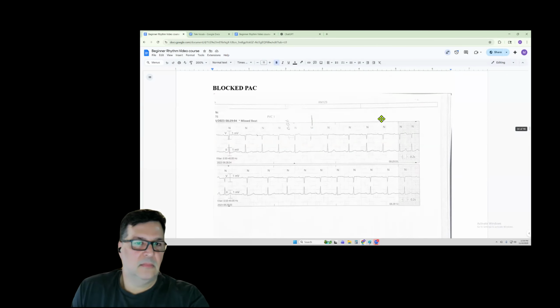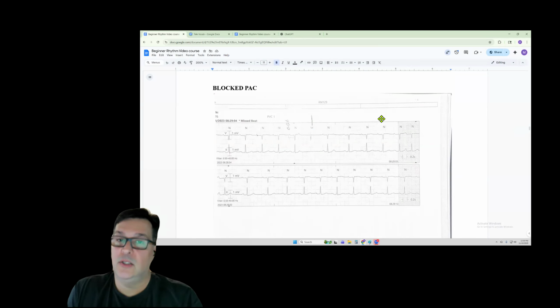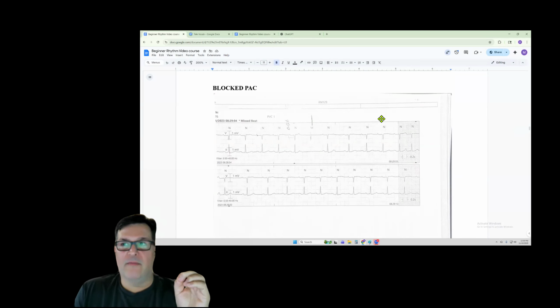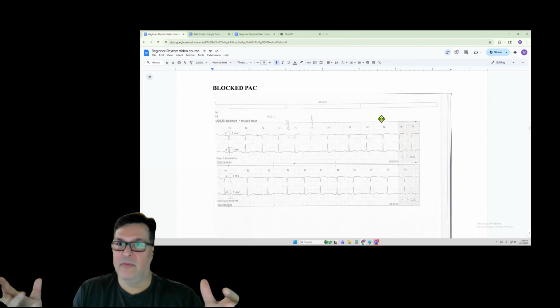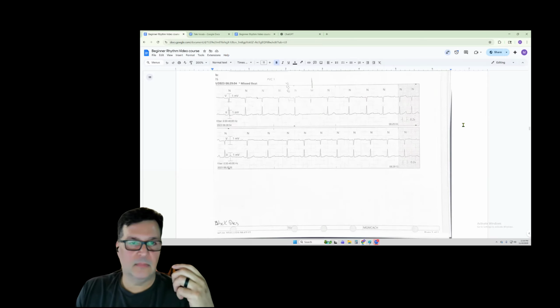You said wide is coming from below, which does that mean the SA node didn't fire and it's coming from those backups? So again, if the heart rate drops, or anything originating from the ventricles, the lower chambers, the right and left ventricle, anything originating solely there is going to be a wide QRS, a bigger QRS complex. Okay. Whereas if it's originating above in the SA node or the atrial chamber, it follows that normal natural pathway down through the septum, the bundle branches, where instead if it's coming from the ventricles, it just goes up. So you're going to have a wide QRS. Okay.